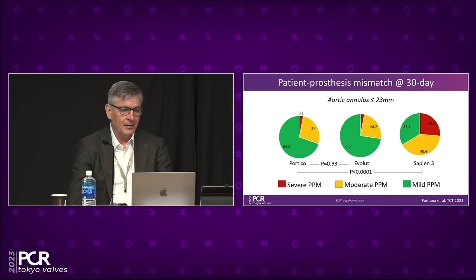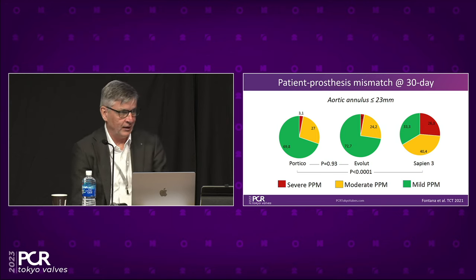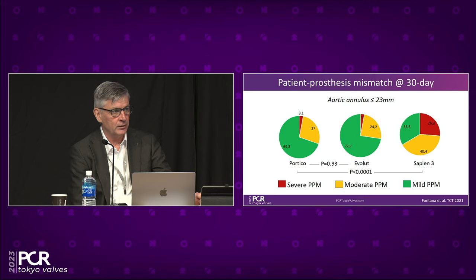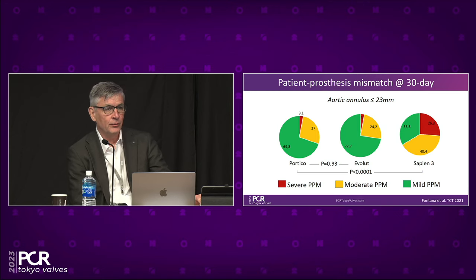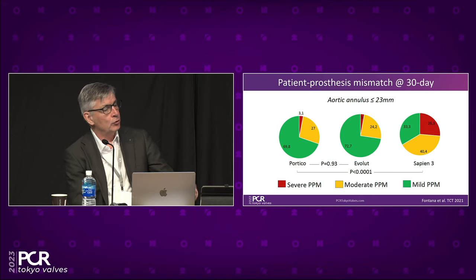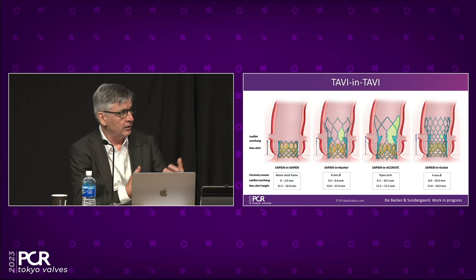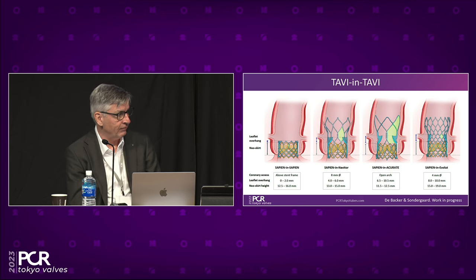So Masa, this patient is 83 years of age, and I don't know the life expectancy, but again, we have seen that in some parts of the world, TAVI has moved down to much younger patients. I saw a report from last year in the U.S. that of patients younger than 65 years of age with severe isolated aortic stenosis, half of these patients are nowadays offered a TAVI procedure. Oh, really? So we also need to think about the next step when these transcatheter heart valves are failing. What are the issues about doing TAVI in TAVI, patients coming back with a failed TAVI valve?